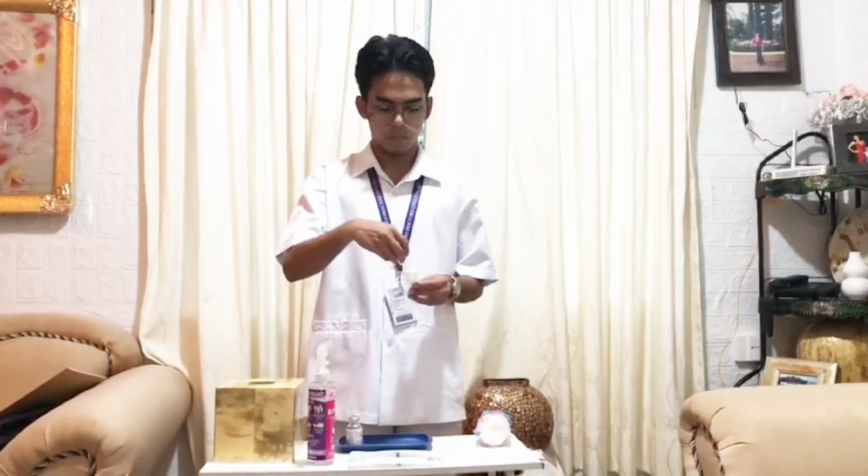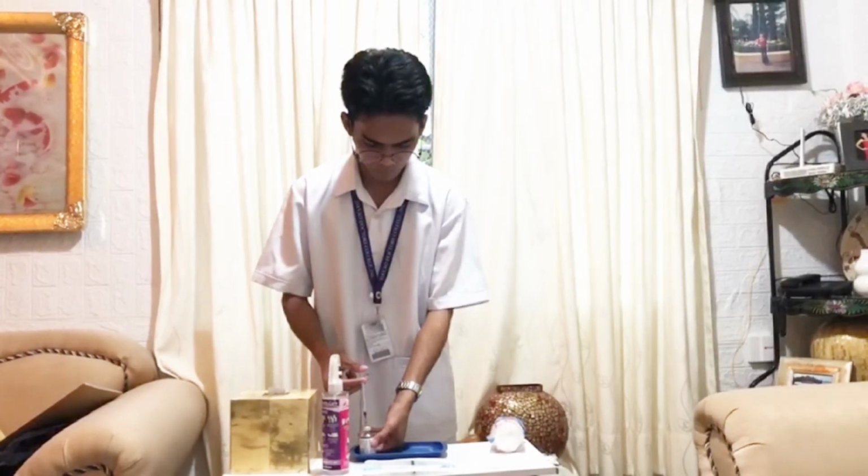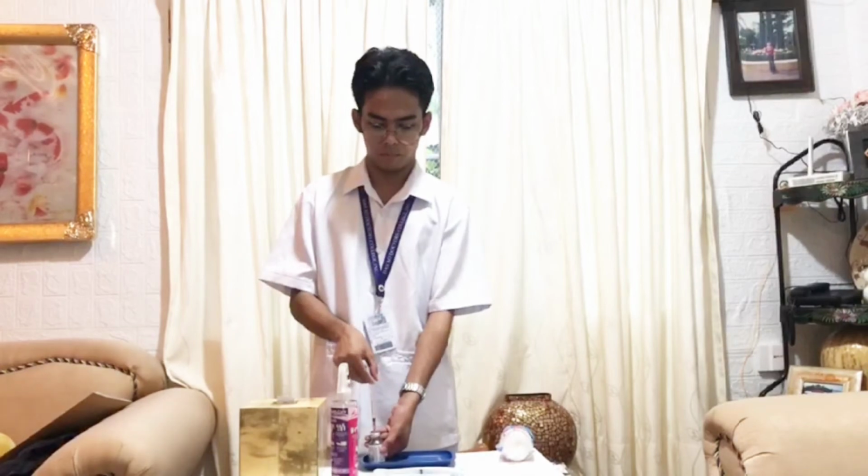After that, I am going to get my syringe and uncap it. And then I am going to draw air into the syringe. Then I am going to push the air into the vial. Pushing air into the vial prevents a vacuum from forming. So now I am going to invert the syringe and draw the exact amount of medication. After that, if you see bubbles in the syringe, then slightly tap the barrel.